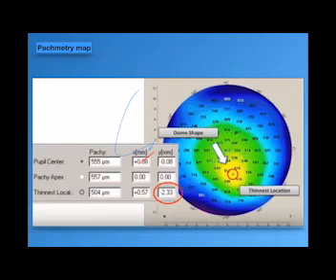No, we said, my dear, that we have to correlate the findings of the Pentacam with the clinical data of the same patient on the slit lamp. You put the patient and the topography and the Pentacam beside each other, and check the same point of abnormality in the Pentacam on the cornea, on the slit lamp.